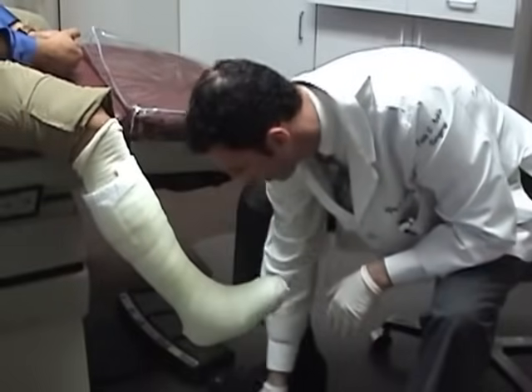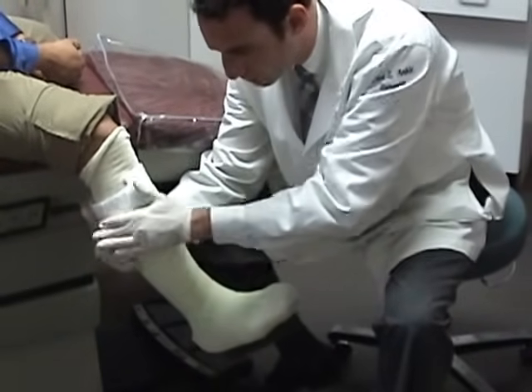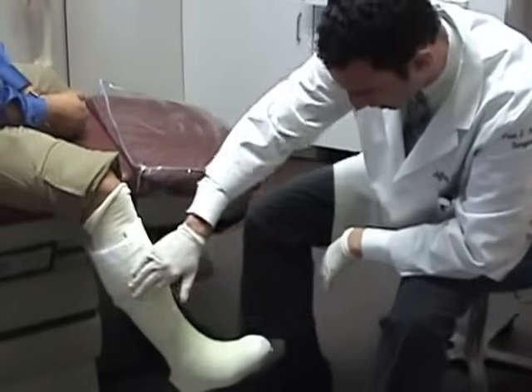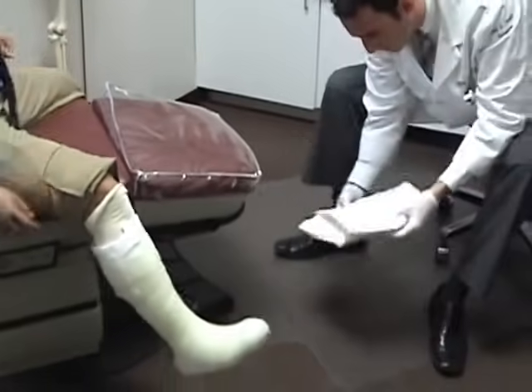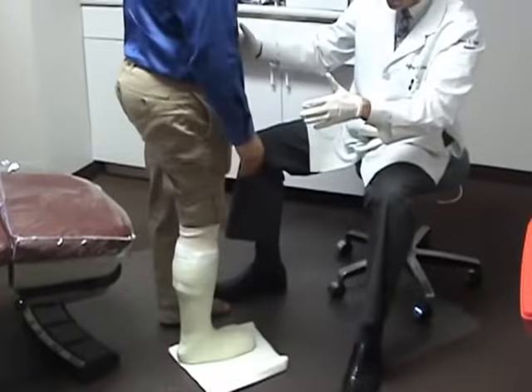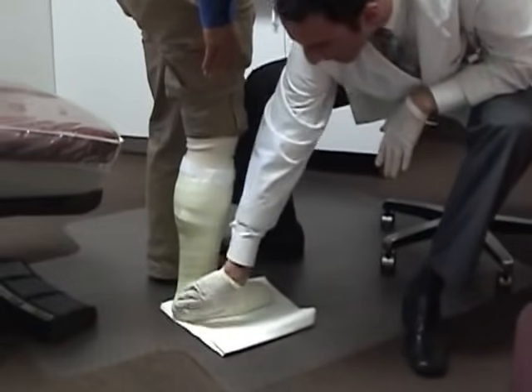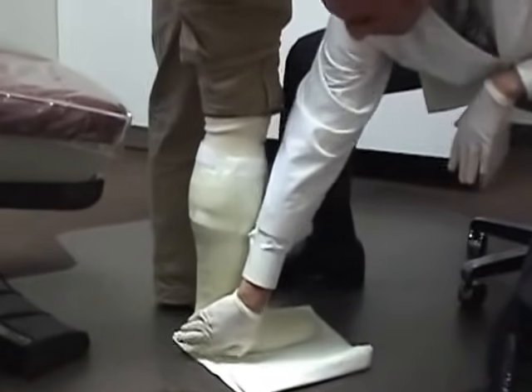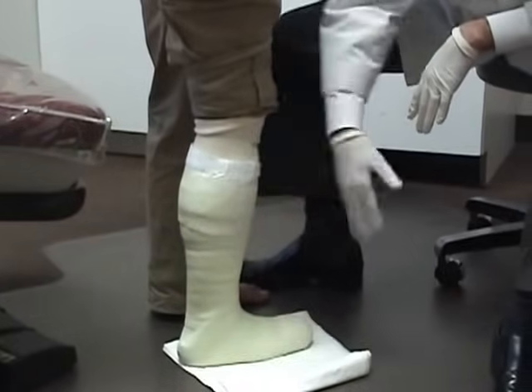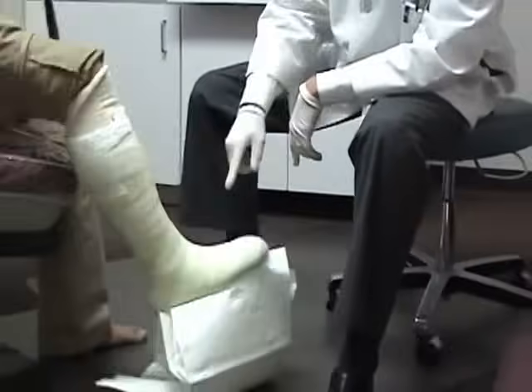Once we have these two rolls on, the next thing we do is have the patient step down on a flat hard surface — sometimes it's a wooden board, sometimes we just use the floor. We'll put this down to protect the floor and ask him to stand up with feet about shoulder-width apart and the knee slightly bent — five to ten degrees is the recommendation. If you see any irregularities in the back you can smooth that out. Have them stand for about 10 to 15 seconds; this will confirm that we have total contact on the bottom. If it sticks, it's a good sign.